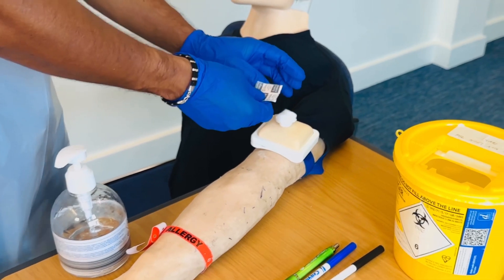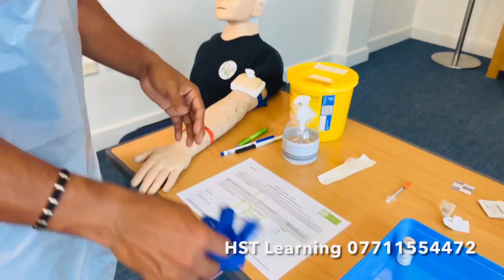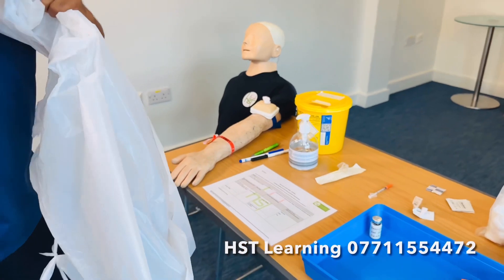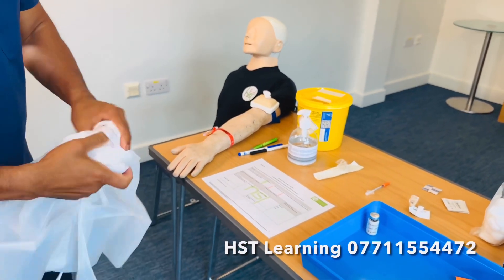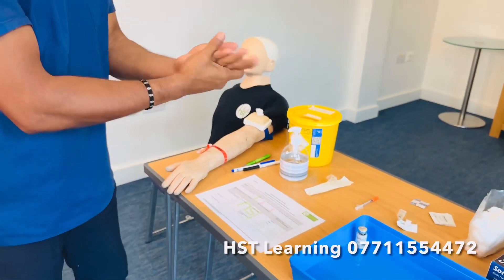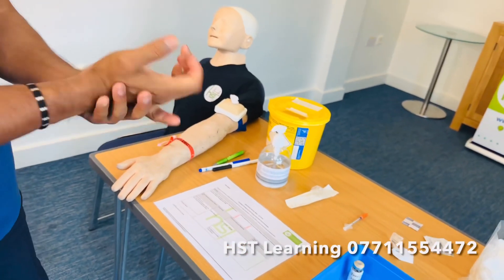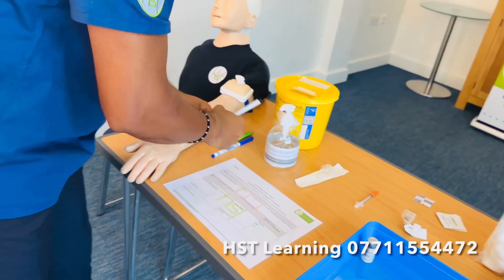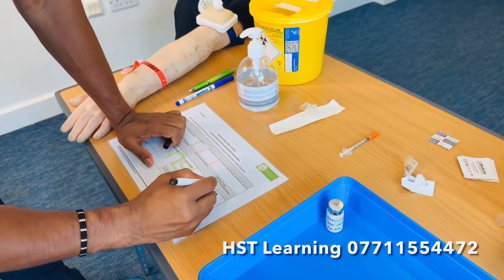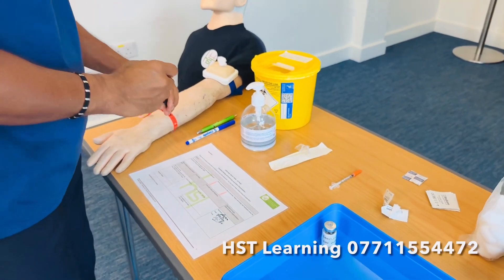Remove your gloves and discard into the clinical waste bin. Remove your apron. Perform hand hygiene. Then complete your signature with date and time — you can put the exam date if applicable.